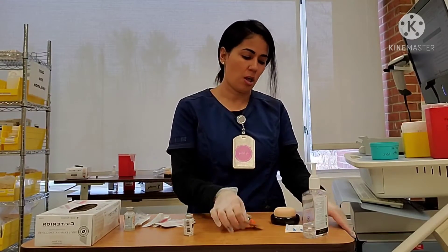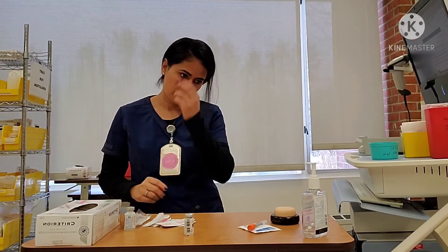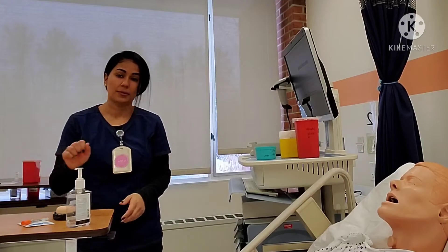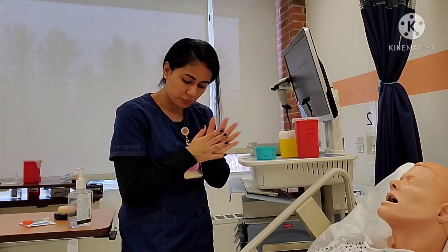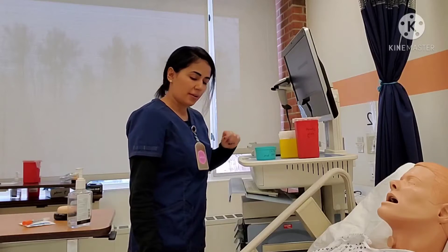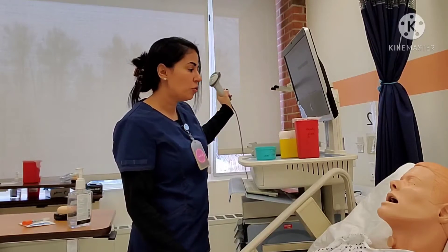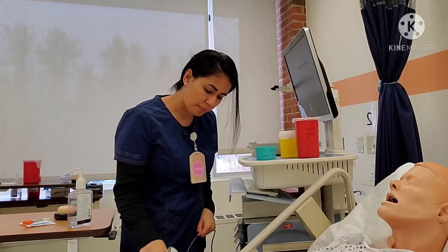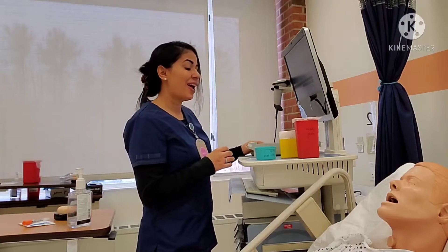I have my alcohol, my gauze, and I'm going to my patient's room. Good morning — my name is Erica, I'm going to be the nurse taking care of you. Can you tell me your name and date of birth? Zach Morris — and your date of birth matches as well. So I'm going to administer your insulin now. Your blood glucose was 250, so based on the sliding scale, you're due for four units of insulin. You'll want to make sure that you eat when the breakfast tray comes around. Are you familiar with signs of hypoglycemia?